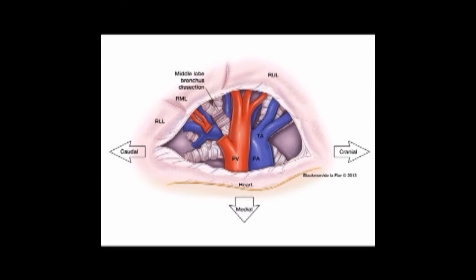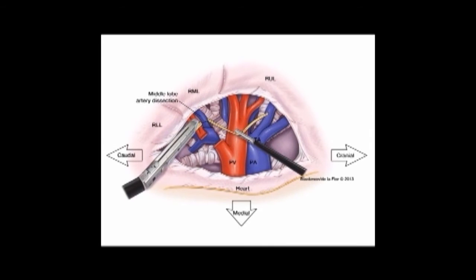Once the pulmonary vein branches have been divided, you should encounter the bronchus going to the right middle lobe. This structure is encircled, stapled, and divided using a bronchial staple load — with Covidien a purple load, or with Ethicon a blue or green load, typically a blue load. Once the right middle lobe bronchial branches have been divided, it will be easier to see the pulmonary artery branches coming off of the basilar branch and going to the right middle lobe. It is important to note that this is exactly opposite the superior segment right lower lobe branch on the opposite side of the pulmonary artery.